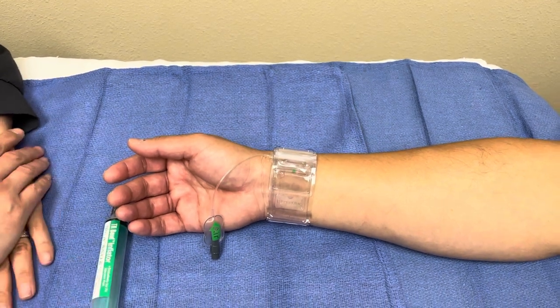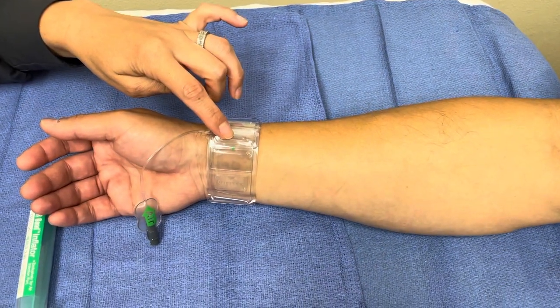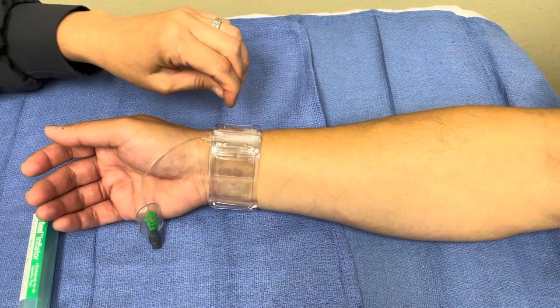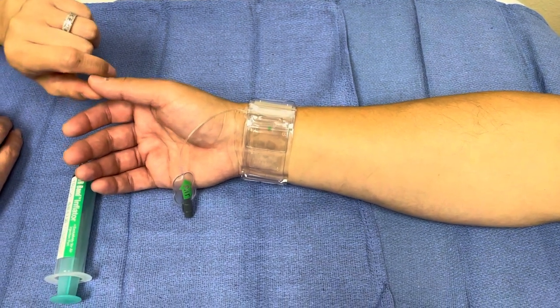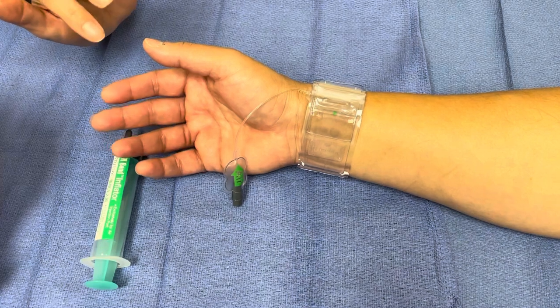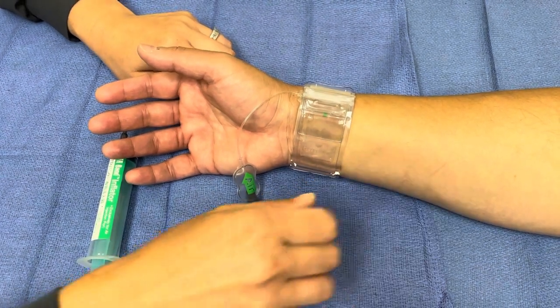Next, assessment. When we get the patient back to you on the floor, you're going to assess the site just like normal. Make sure that this is not actively bleeding. There will be blood in here — that's normal because we do it with bleed back. We watch for blood to come back and then we add some more air. We're also going to look for good circulation, good blanching. We can put a pulse ox to watch the waveform. They can wiggle their fingers. Most of the time we will not just wrap it up because we want to assess behind and in front of the band and make sure there's no swelling back here.